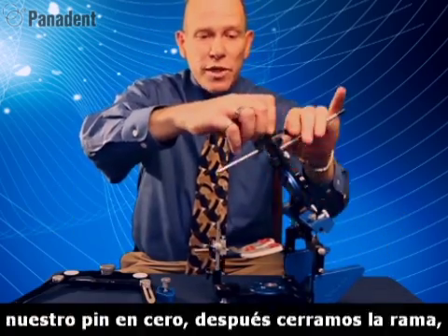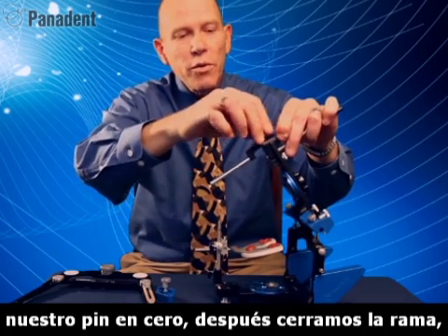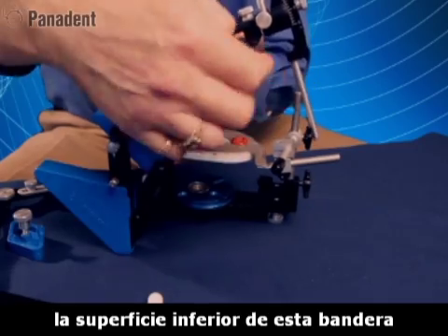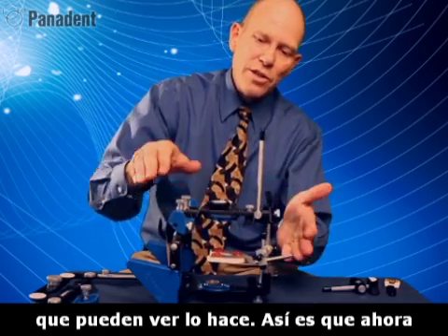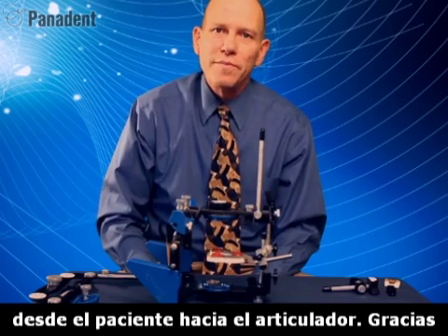Now if I set the incisal pin at zero, then when I close this frame down, the top of this pin should equal the bottom surface of this flag, or the bottom surface of the upper frame here — which you can see it does. So you can see how this has all been engineered from the patient to the articulator. Thank you.